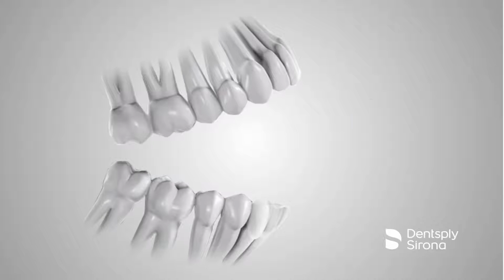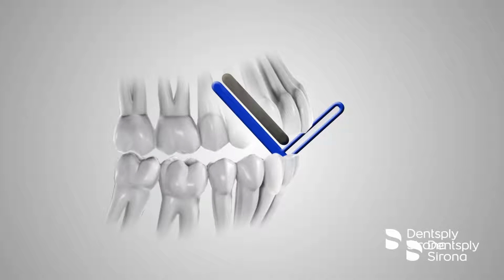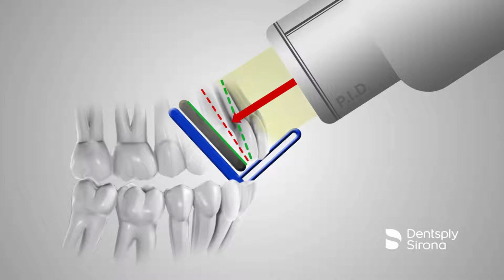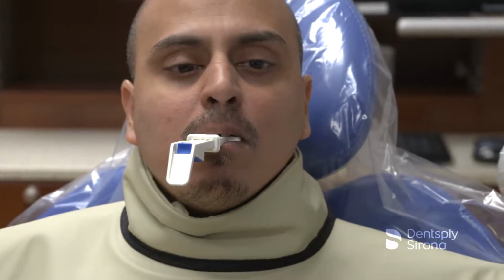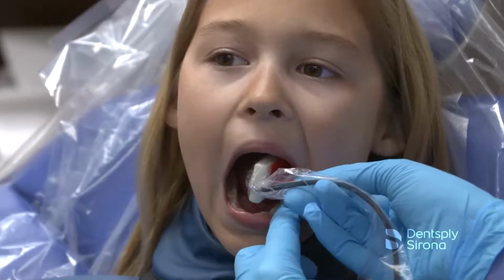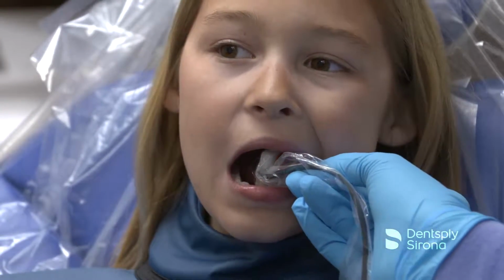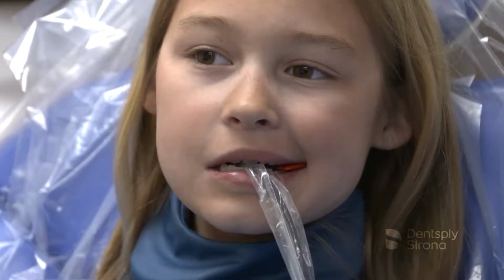The bisecting angle technique is an alternate approach for periapical radiography. With this technique, the receptor is placed diagonal to the long axis plane of the teeth. The beam is then directed at a right angle to a plane that is midway between the receptor and the teeth. This method produces less optimal images because the receptor and teeth are not in the same vertical plane. However, it is a useful method when ideal receptor placement cannot be achieved due to anatomical obstacles or placement difficulties.